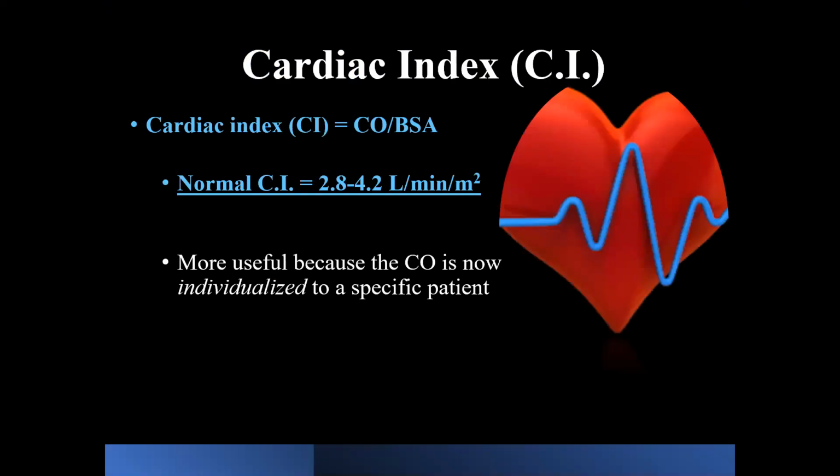Now, cardiac index is a much more specific and individualized way to know what's going on with the patient, because it factors in the patient's body surface area. And again, I don't do this by hand calculation. The monitor does it for me.